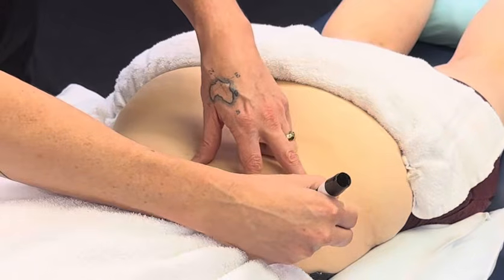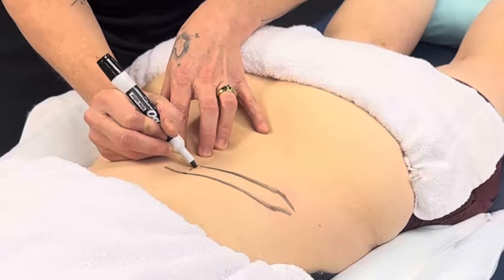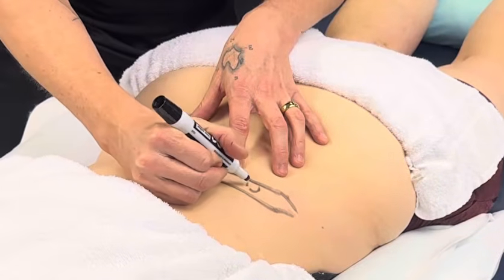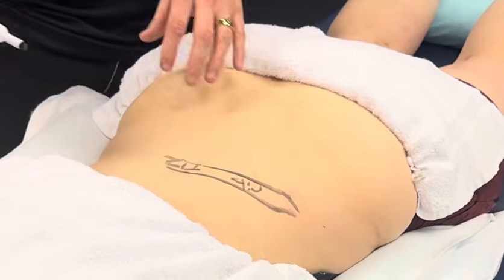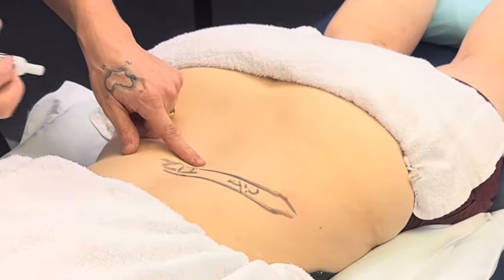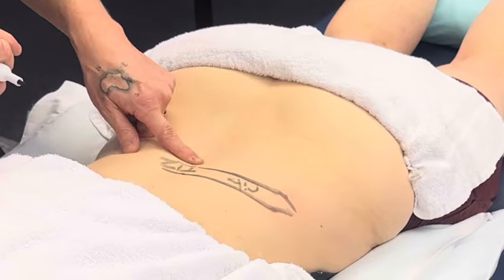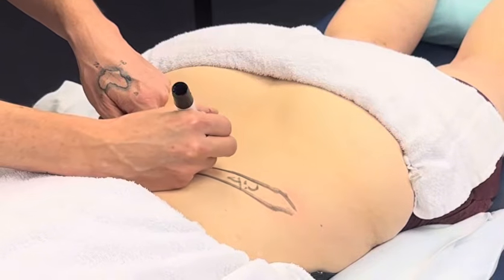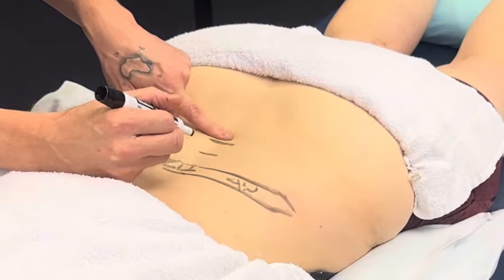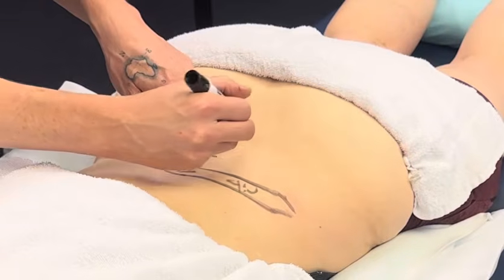And it's a floating rib, right? So it has an end, okay? T12, rib. There's another spinous process. If I just roll my finger down, there's the interspinous space. There's the next spinous process. There's the next interspinous space. There's the next spinous process. There's the next interspinous space.